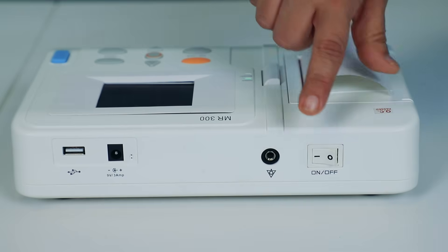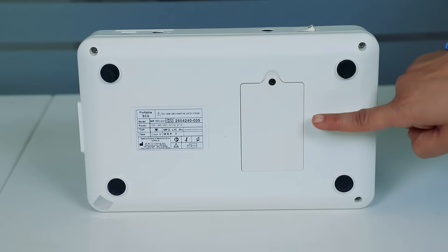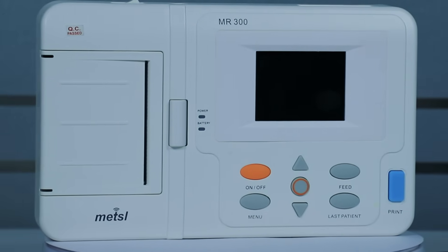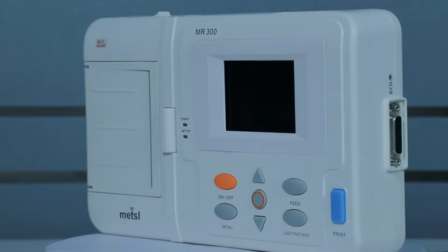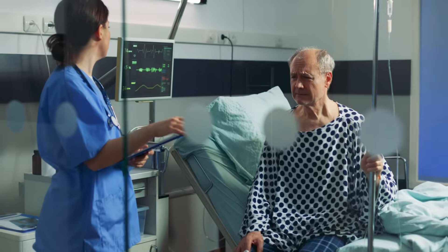On the sides, we have various ports for connectivity, and at the rear, the convenient battery compartment. One of the key features of the Maestro MR300 Mini Machine is its remarkable compactness and portability. Its lightweight design makes it ideal for use in various clinical settings, like clinics, ambulances, nursing homes, and hospitals, offering maximum flexibility.